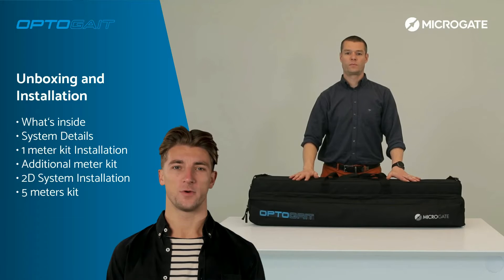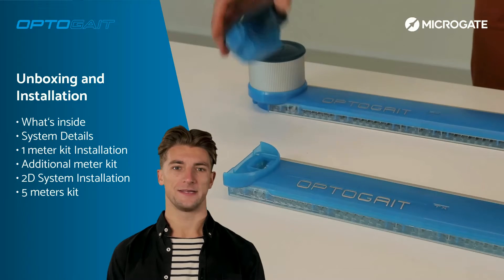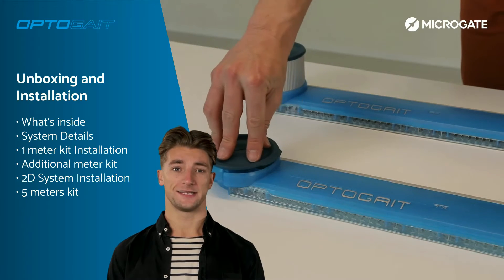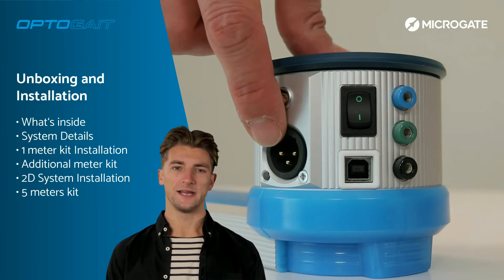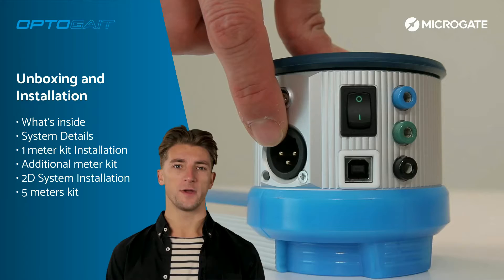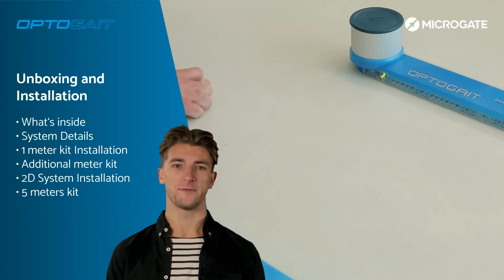Welcome to section 1 of this course. In this section, we will unpack the OptoGate system and carry out its installation step by step. We will see in detail all the accessories contained in the bag, and the technical and technological features that make our bars the gold standard for those working in the medical and rehabilitation field at the highest levels.